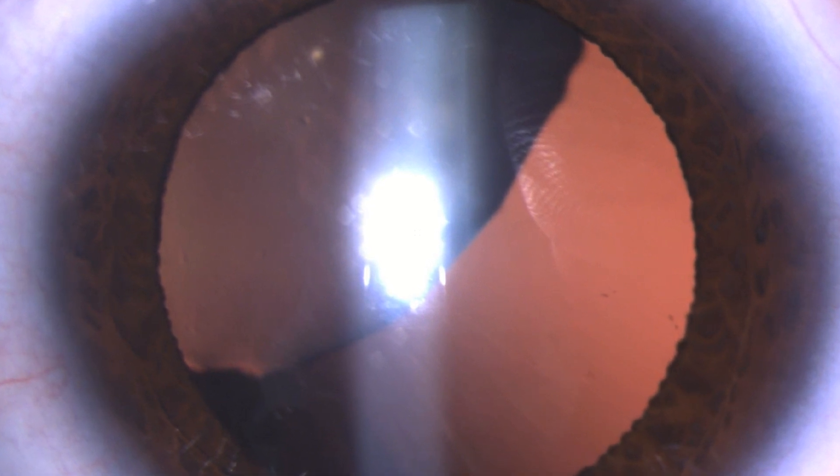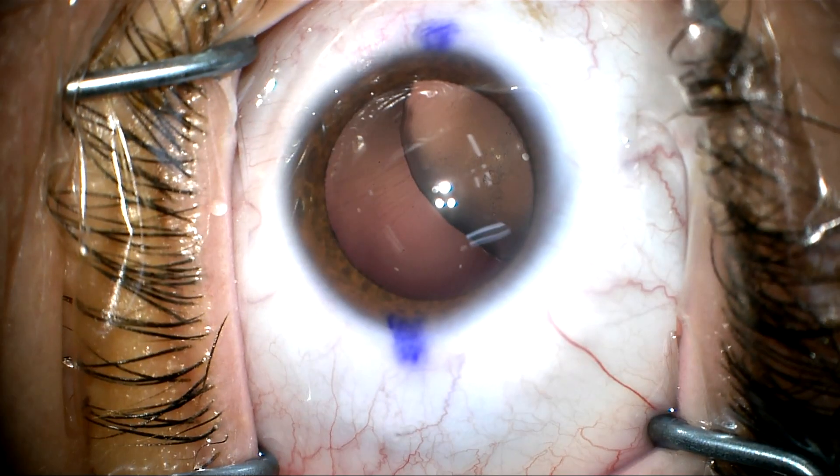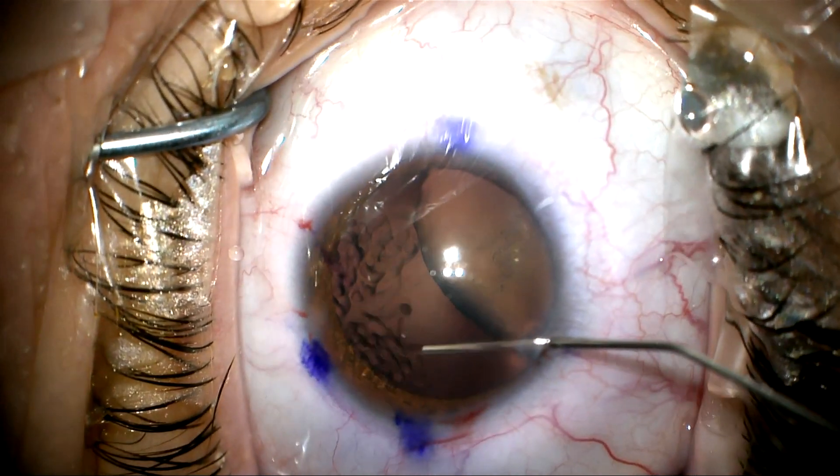This is a 19-year-old with ectopia lentis in her only seeing eye. Her other eye is amblyopic. She's referred for cataract surgery and has four diopters of corneal astigmatism, so we'd like to place the toric lens.